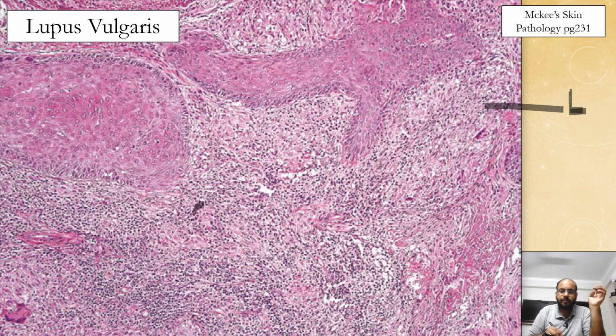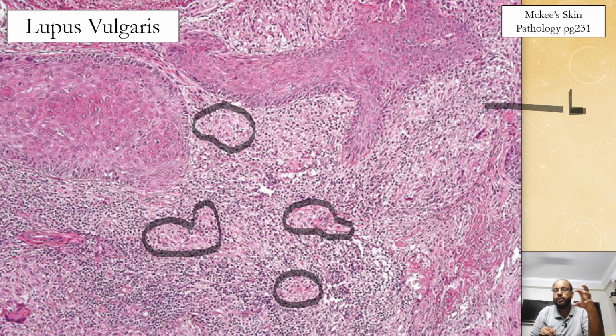And in between them, you will see this kind of ill-formed granulomas. Can you see that the boundaries are not that distinct? They are fuzzy. It is a bit difficult to separate granulomas from the background lymphocytic infiltrate. For example, here you can with difficulty only make out this kind of collection, but if you look closely, the areas of granulomas are pinker as compared to the background basophilic lymphocytes.